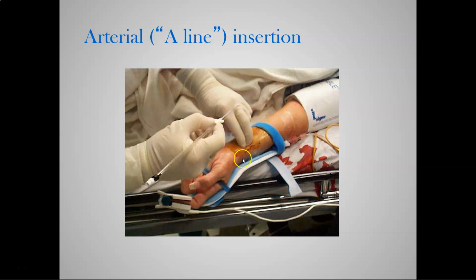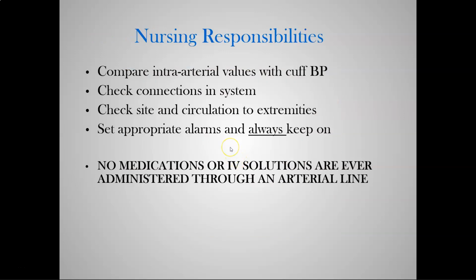I'd like to point out, as a nurse, you've got some things you definitely need to be aware of here. I mean, you're not the one putting it in, but you're going to be the one who may identify the need or indication for an art line. You're going to be the one that maintains the art line, and you're going to be the one that's going to have to troubleshoot the art line after it gets placed, probably.